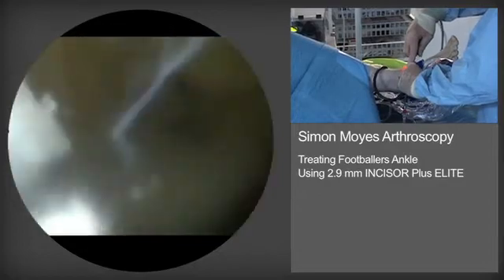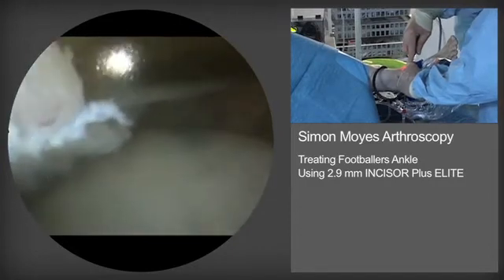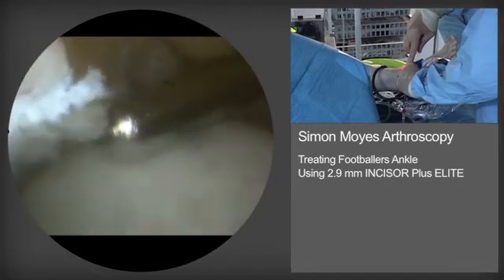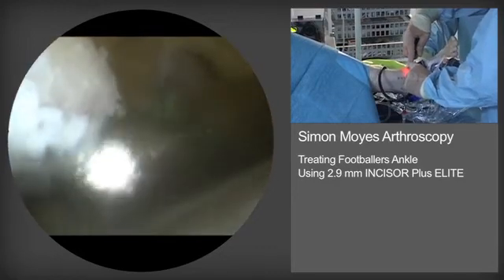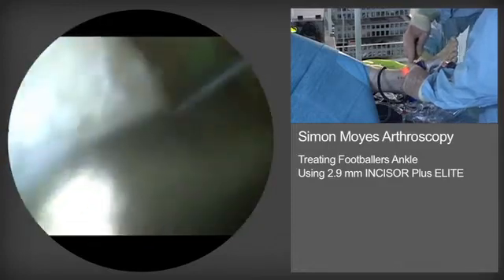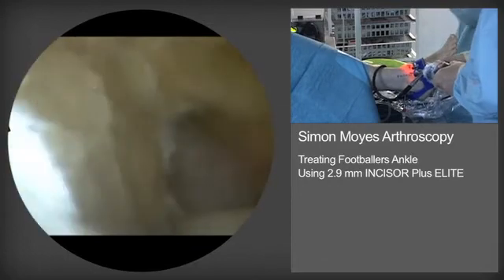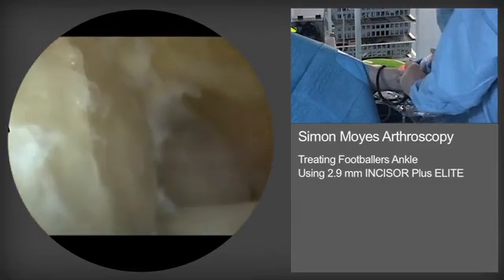As one carries out resection of the tibial spurs, one switches regularly between a soft tissue resector and an oval burr. As you'll see in the foreground, there's a small amount of the tibial spur that still needs to be removed.